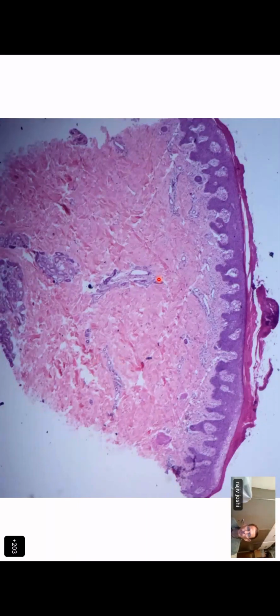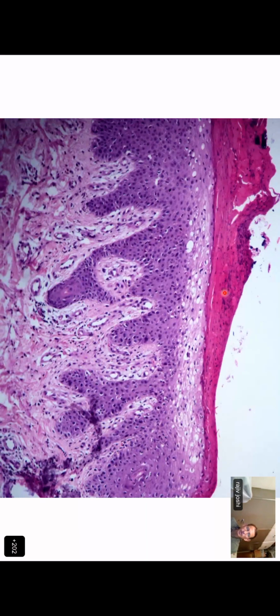Good. So, there is psoriasiform hyperplasia, and as you rightly pointed out, there is this very large area of pallor here, a little bit of pallor over here, which at higher power you said was ballooning. And there is almost a confluent crust over it. So you can see this crusting and parakeratosis here. There are neutrophils. There is no vesicle as such here. There is no intraepidermal vesicle formation. The primary pattern here is that of ballooning. There is irregular psoriasiform hyperplasia, and there is ballooning, which you rightly pointed out.